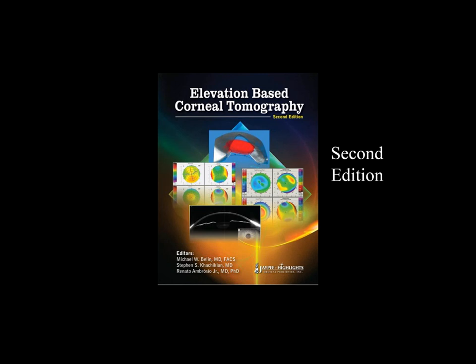The elevation maps, remember that 20-year-old slide I showed you? The elevation maps will look like there's displacement, but the pattern will not be abnormal. And that's the problem with curvature. You get a patient with positive angle kappa, you'll have a suspicious-looking curvature map. But the elevation maps will look like they're displaced, but the pattern is normal.